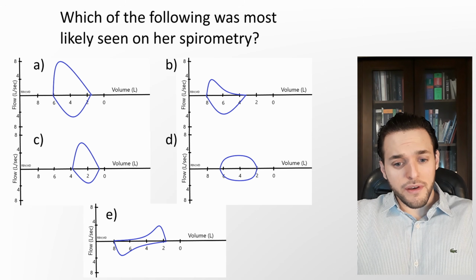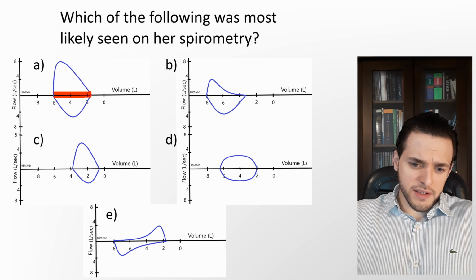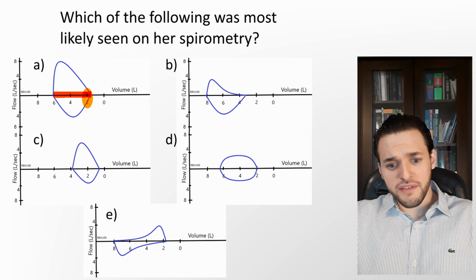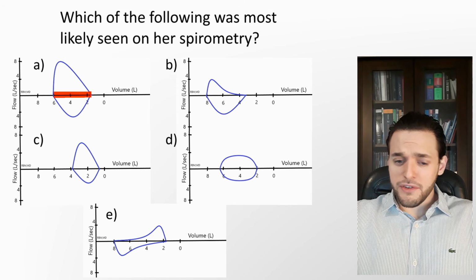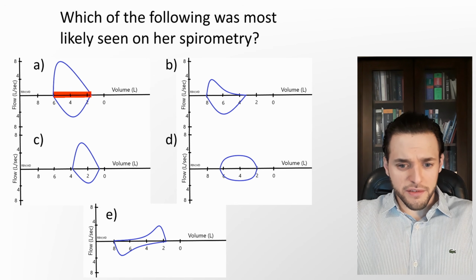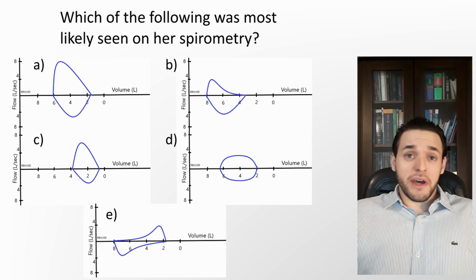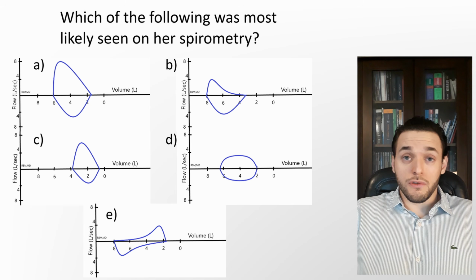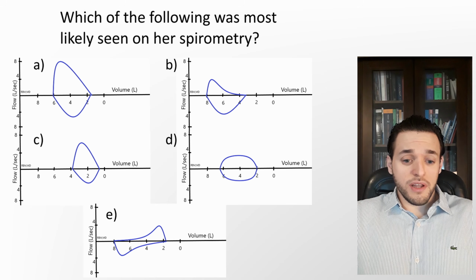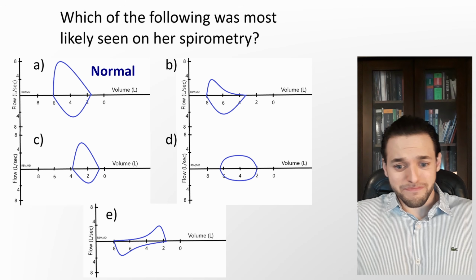And so here we also have a vital capacity around 4 liters, slightly larger. We have it starting slightly before 2 liters and ending in 6 liters. We have a total lung capacity of 6 and a vital capacity around 4.5 liters. Well, this is on the upper limit of normal, but we have here a patient that runs, or at least used to run every week, so perhaps this will be normal for her. So this will be the normal spirometry. This is exactly what we would expect from a healthy patient.